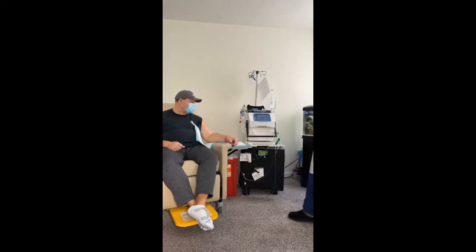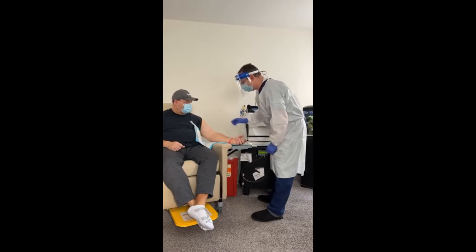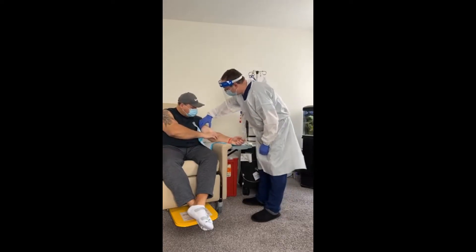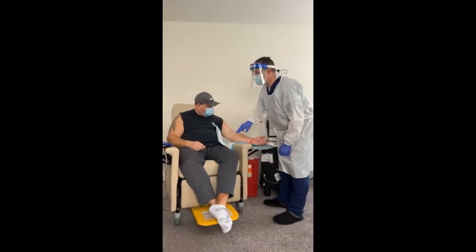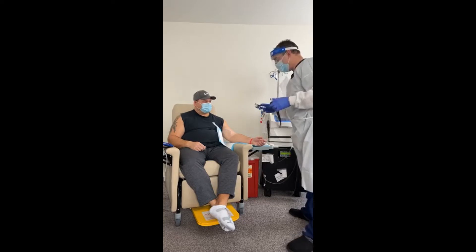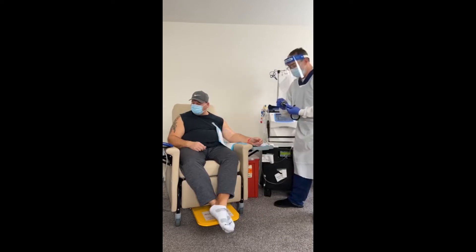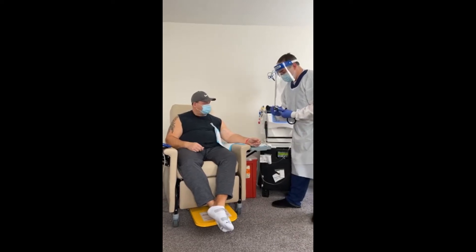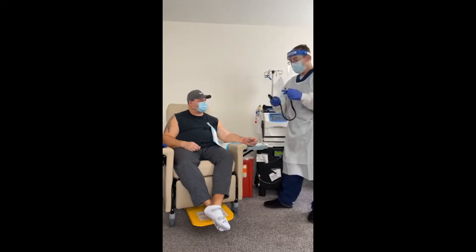We are here with the one and only Mr. Gonzalez. What we're going to do today is something a little different — we're going to do some wet sticking. You might be asking, what is wet sticking? Wet sticking is when you apply the saline into the needle and into the tubing, and it helps you identify where your needle is, if it's placed right.